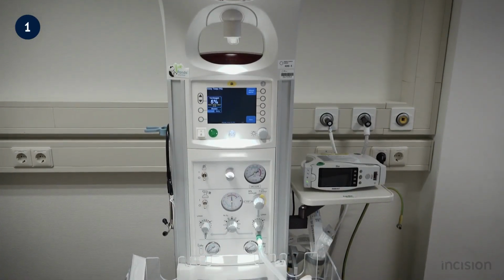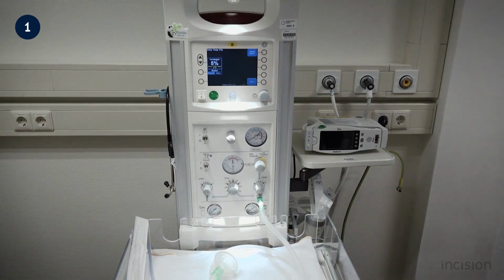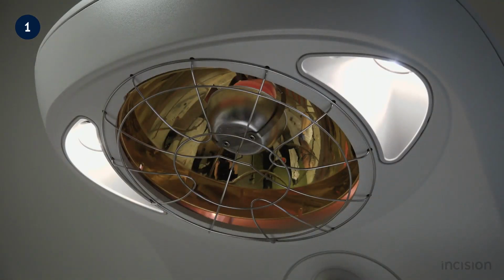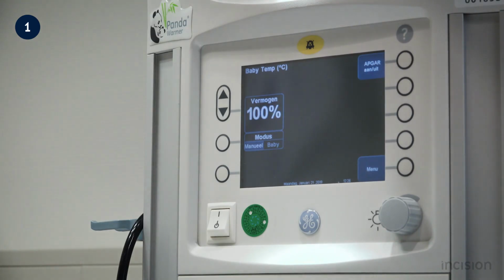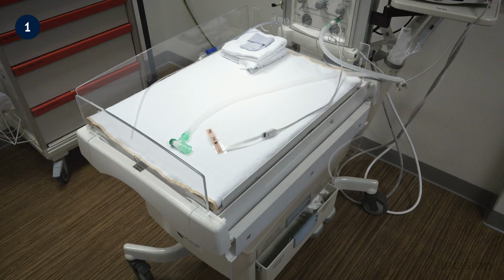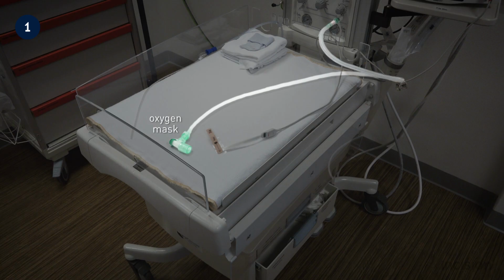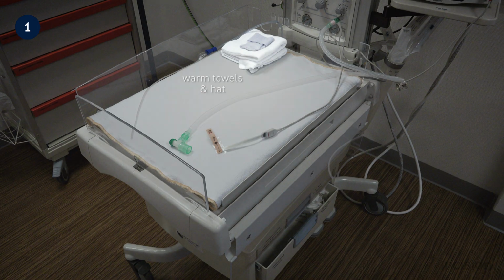For each delivery, a healthcare professional should anticipate the need for resuscitation by preparing the neonatal resuscitation unit appropriately. The heater is switched to 100% in order to reduce neonatal heat loss and the risk of hypothermia. Next, the following instruments are assembled on the resuscitation unit: a suction device, saturation meter, and an oxygen mask. In order to dry the baby and maintain neonatal temperature, warm towels and a hat are prepared.